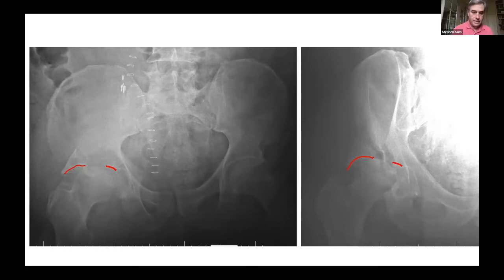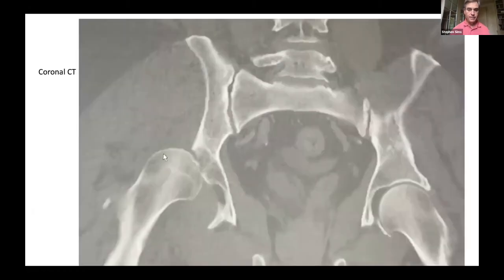Okay, so this is a posterior superior wall acetabular fracture. It was described by Letournel in his book, as was everything else that I think I've invented later on. The difference is the ones that involve the radiological roof, as opposed to those that don't, are these posterior superior wall fractures. Again, I think the key point here is that most of these can be reduced. There are just some rare ones like this that don't really have anything remaining.